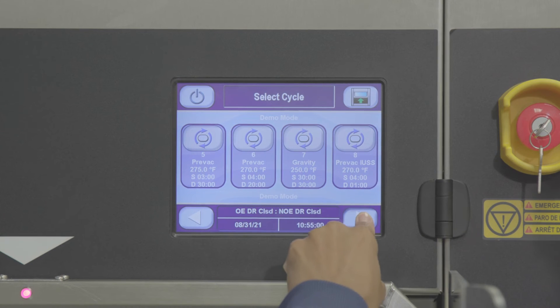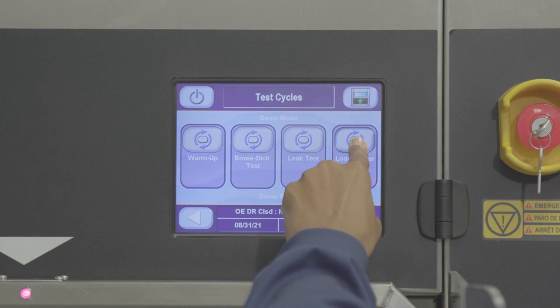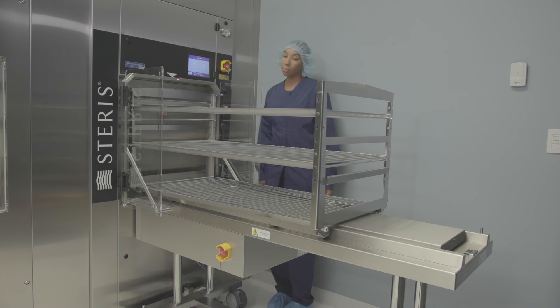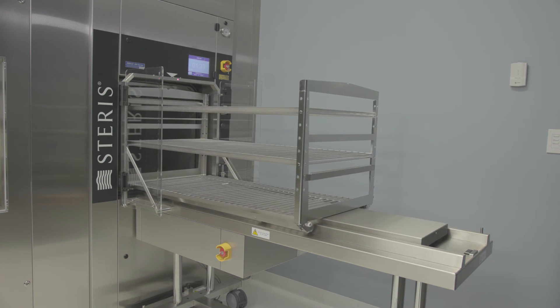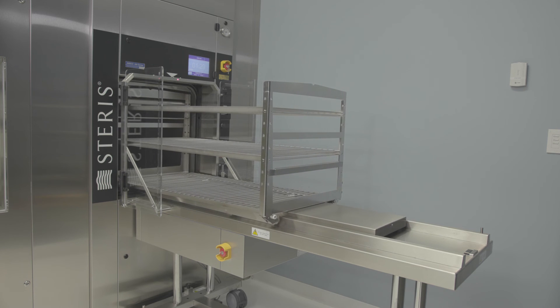To return an empty loading car to the clean side using the empty chamber, simply select the loading car return cycle on the cycle select screen. You'll hear a beeping sound indicating the automatic loading process has started. To minimize air passage between the clean and sterile sides, the sterilizer doors can be set up to interlock so only one door can be open at a time.